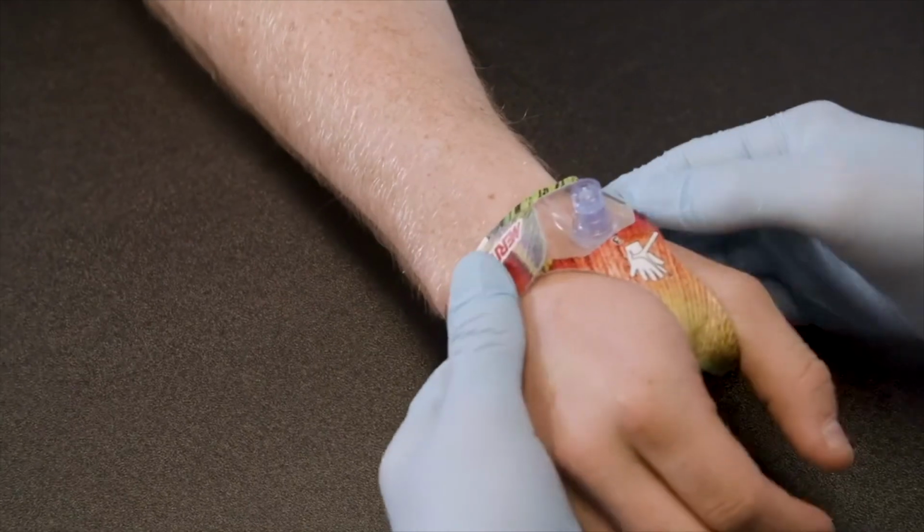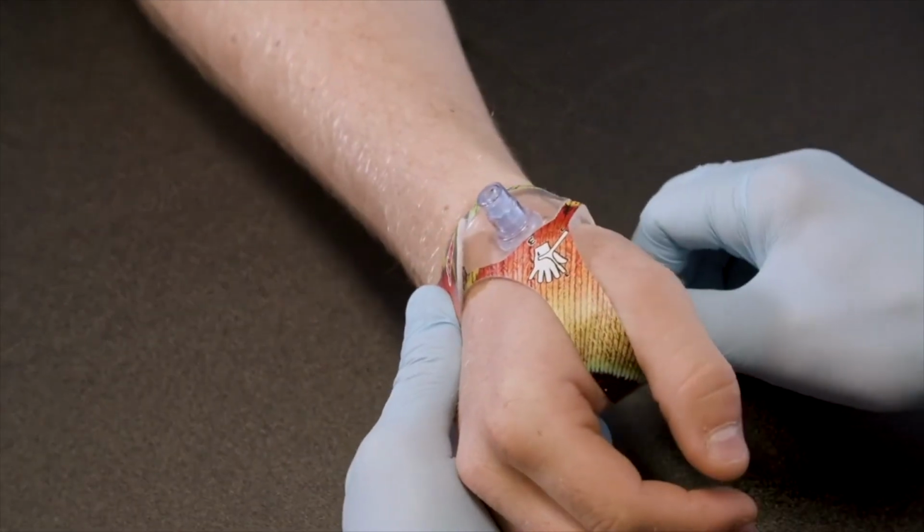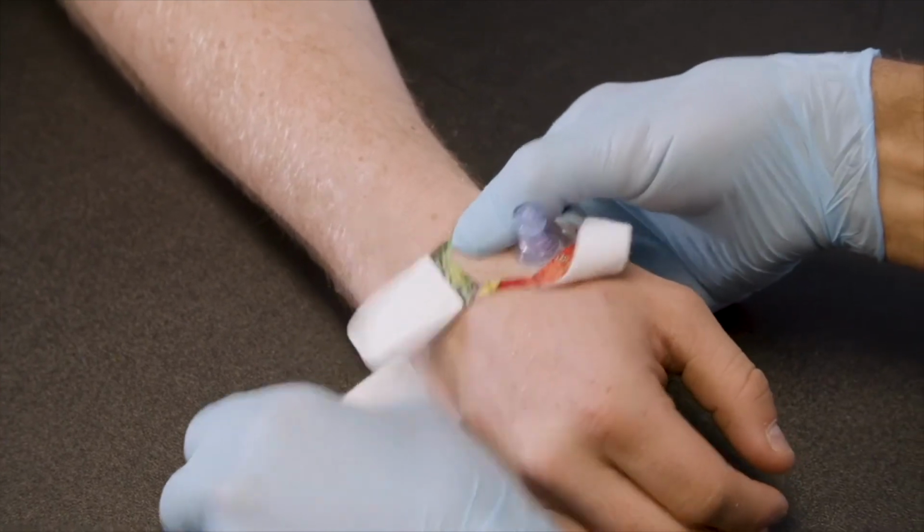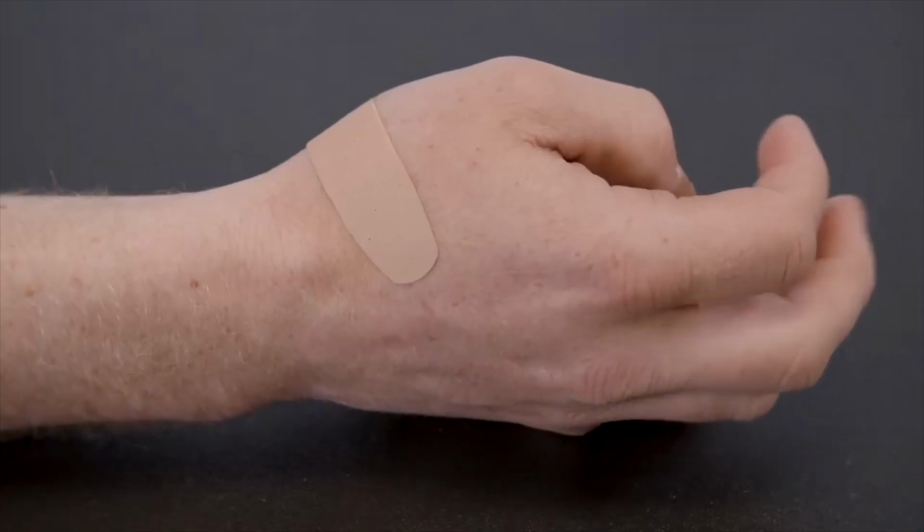Complete hemostasis time may differ according to the patient's condition, anticoagulant dosage, and size of the puncture site. If bleeding is present, inject air until bleeding stops and patent hemostasis is achieved. Wait a sufficient amount of time and repeat the device deflation and removal instructions. Once the air is removed and hemostasis is confirmed, carefully remove the Prelude Sync Distal and place a sterile dressing over the site per hospital protocol.